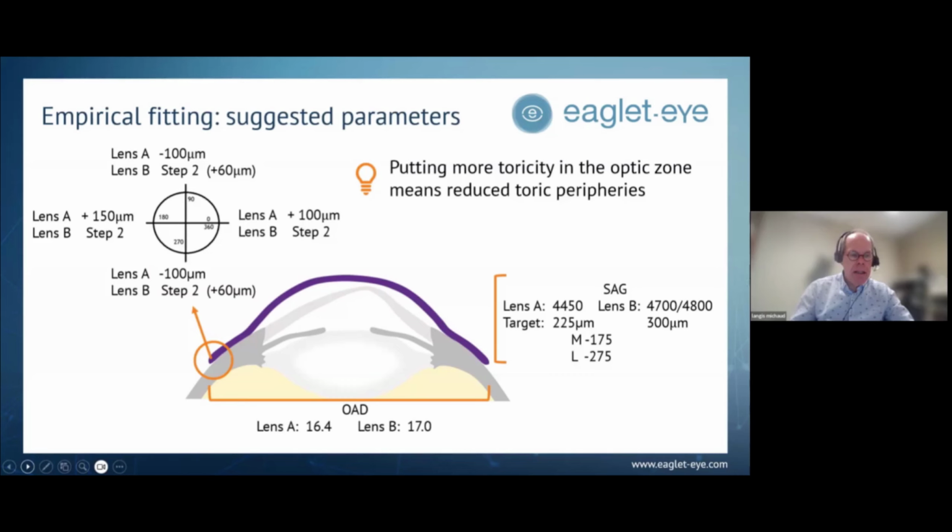So again, by elevation on that side, with the targets to vault by 225 and 300 microns, no more than 300 microns over the cornea. And we know how challenging it is, especially when we have a severe keratoconus, to vault minimally over the cone, never touching the cornea, and vaulting symmetrically with other parts of the cornea, especially the superior cornea, where the cornea is flatter.